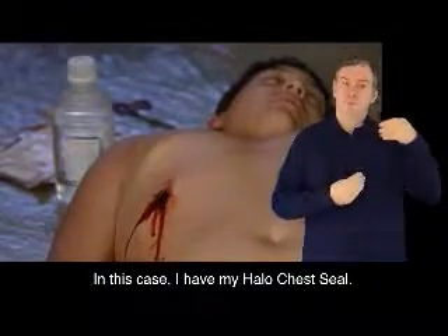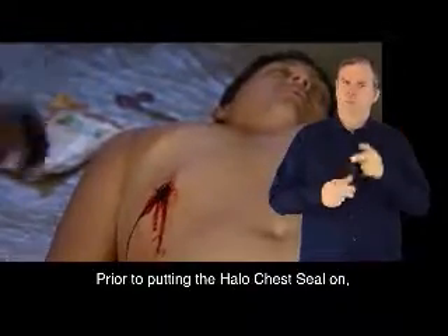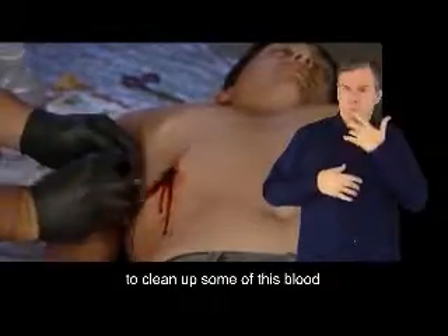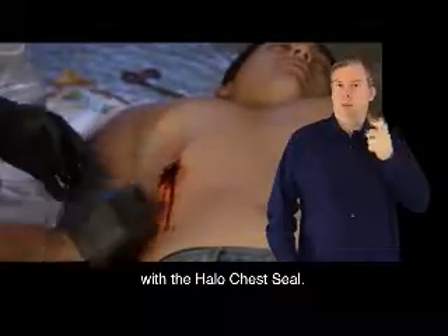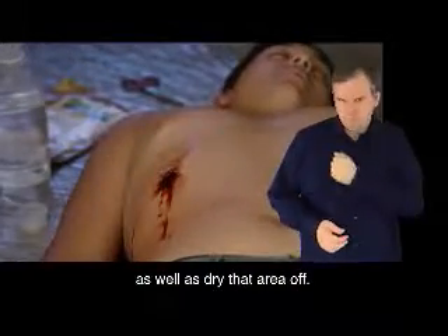In this case, I have my Halo chest seal. Prior to putting the Halo chest seal on, I'm going to use a little bit of sterile saline to clean up some of this blood around the wound so I get a better seal. I'll clean up the blood a little bit as well as dry that area off.